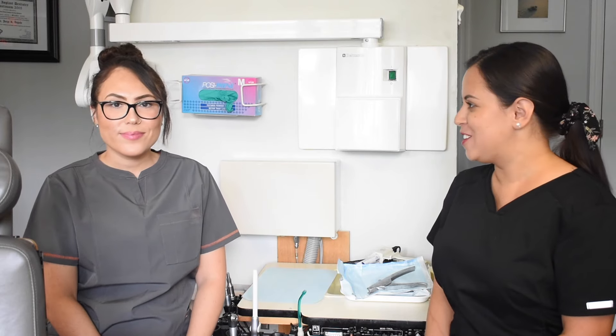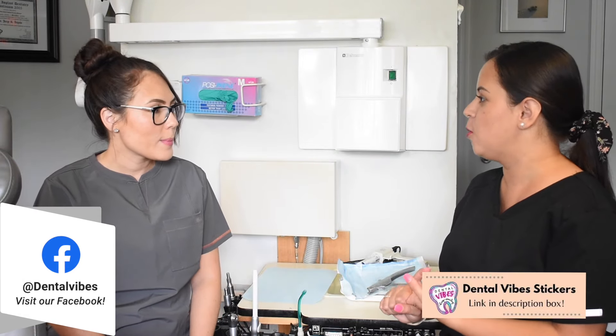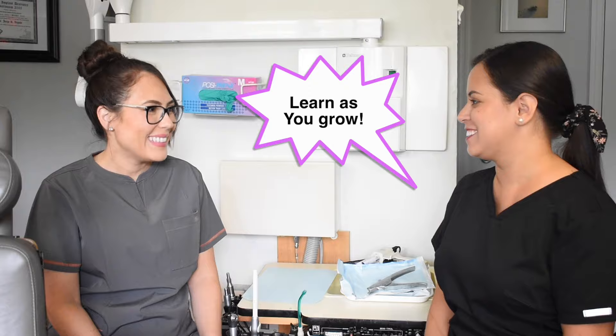Before we get started with our patient, let's review a few things — how to hold a suction, how not to do it, and some other tips. We'll also put out the actual methods you probably heard from school, which we probably forgot already since it was so long ago. We've all learned our own little techniques.